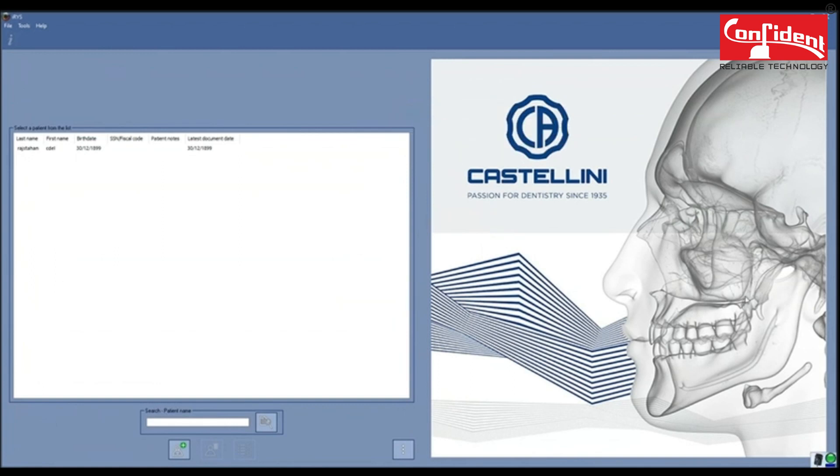When you minimize this window, it will go and sit in the bottom right corner.